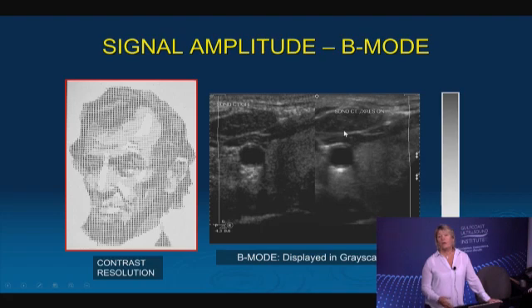And by knowing what the normal characteristics are of these various types of structures, we can then determine is it normal or abnormal. Now you'll even notice that on this particular image, I have it as a dual screen. It's the same structure, but notice that the grayscale is a little bit different. This one is a little bit more contrasty, and this one has more gray shade.